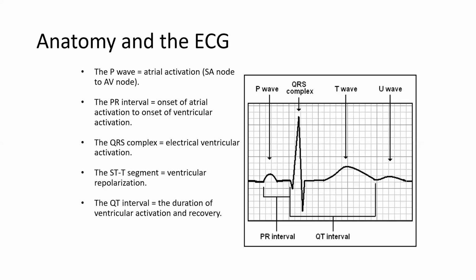Of course, on that structure, there is the U wave, which is the last one there. The U wave represents electrolyte imbalances of your patient. Sorry for that. You need to check on the electrolyte imbalances of your patient once you see a U wave. And when you see it, mostly it is an upward deflection. It is positive in nature, the U wave.